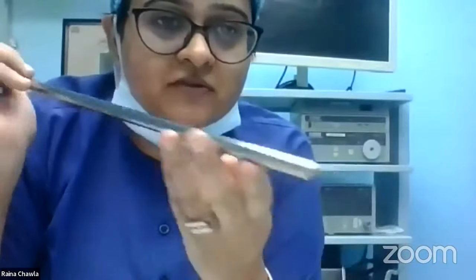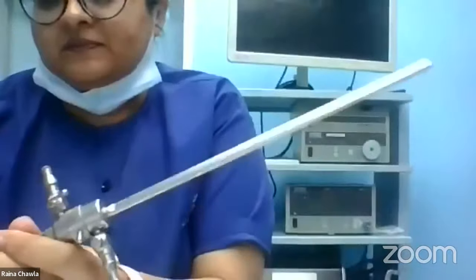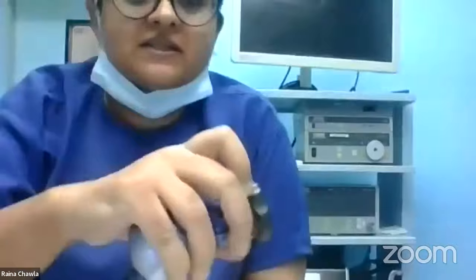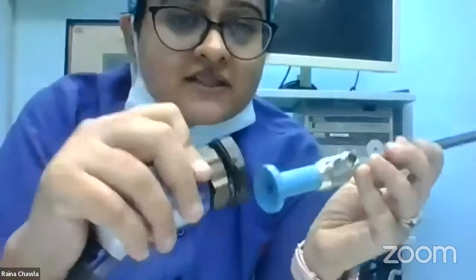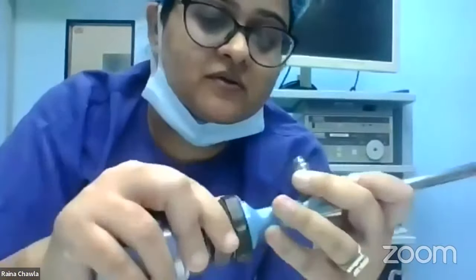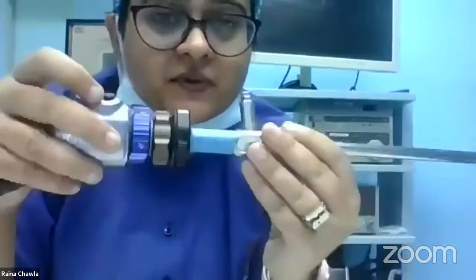A laparoscope is this instrument. Okay. This is basically a scope, which means you can visualize. So it has a lens there. You can see the lens. And to this side, we attach the camera. Okay. So this is the camera. We attach it to the laparoscope. Okay. So this is how we attach it.